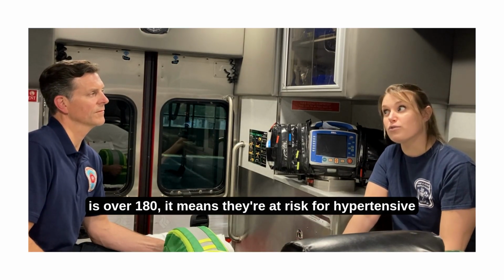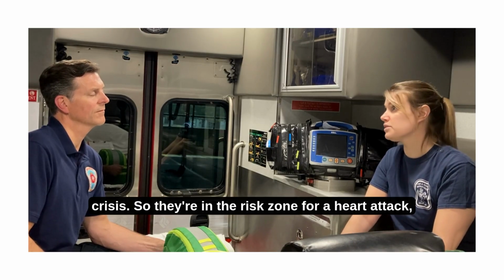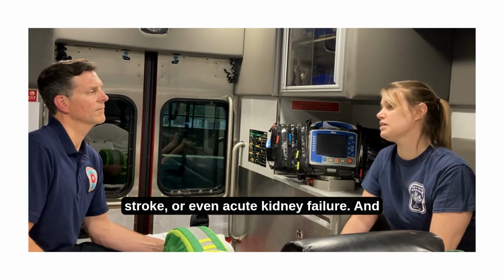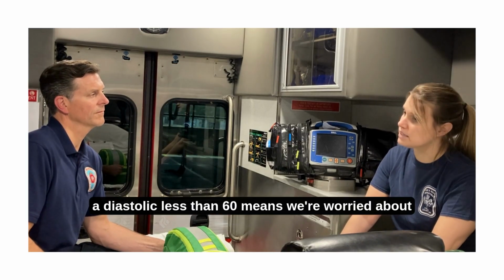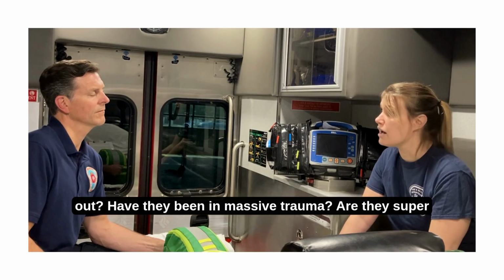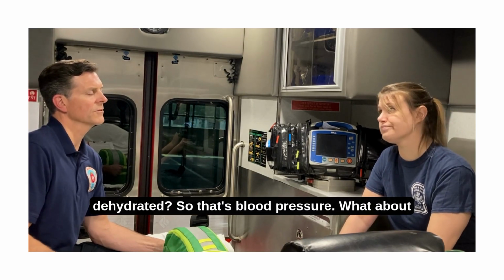If a systolic is over 180, it means they're at risk for a hypertensive crisis. So they're in the risk zone for a heart attack, a stroke, or even acute kidney failure. And a diastolic less than 60 means we're worried about blood volume loss. So are they bleeding out? Have they been in a massive trauma? Are they super dehydrated?